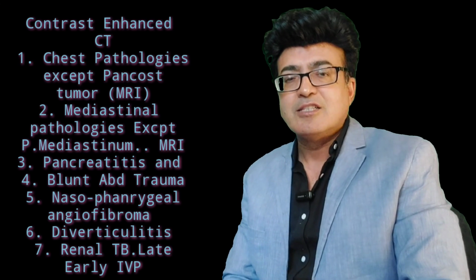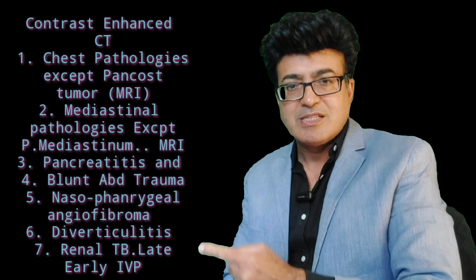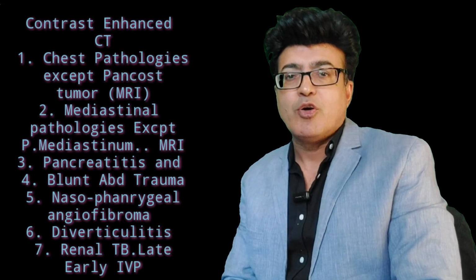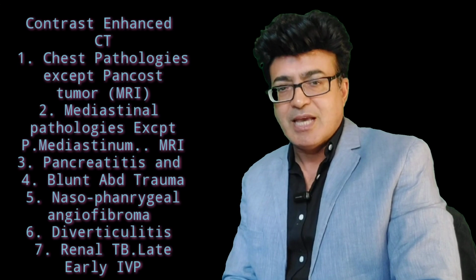So these are the lists which have been given to you here. You can see on this line all these diagnoses can be made on the contrast enhanced CT images.